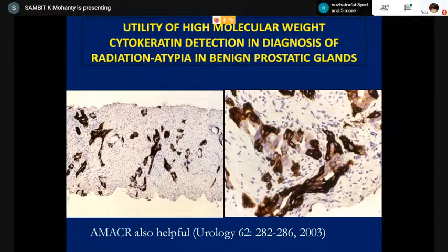I can show you in my next class or send some pictures in the group. I have a complete PIN lecture, but right now it's difficult to open. I don't know in which computer that is. So you have complete circumferential involvement of the gland or partial involvement of the gland, and it is mostly on the luminal cell. Small gland disease is not PIN. When you have a small gland disease, it is cancer or mimics of cancer or something else. But PIN is not in the picture. Okay, thank you, sir.